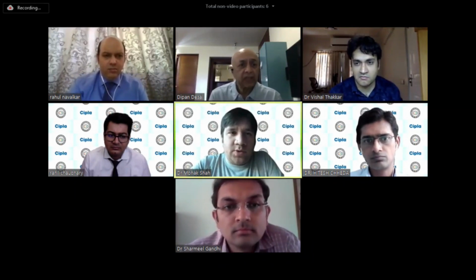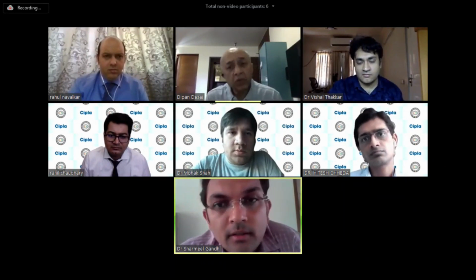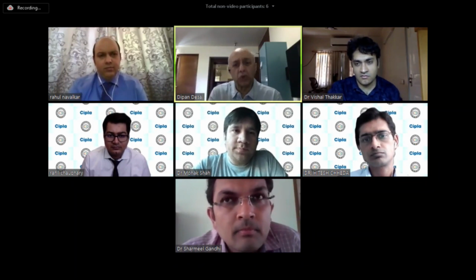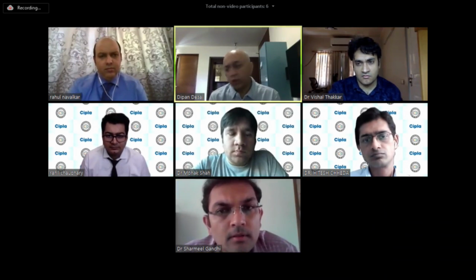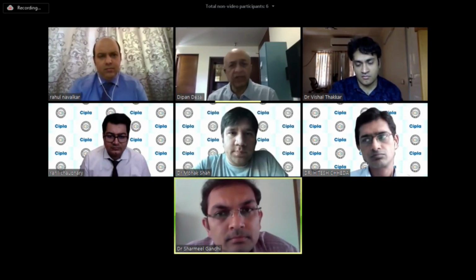Sharmil? I have not observed anything. Yeah, you're right, absolutely. Sharmil? Sir, I didn't get your question. By using toric lenses post-operatively, do you get any spherical aberrations? Spherical aberrations in the sense that do you get any higher order, or let's even forget the higher order, whether you get a spherical number post-operatively? Yeah, of course, sometimes, but not more than 0.5 I've observed. Yes, so you're absolutely right. Most of these lenses are now manufactured so well that you do not get these things.